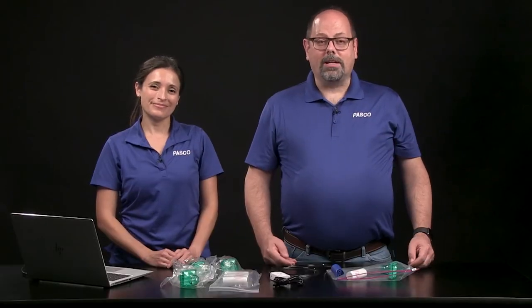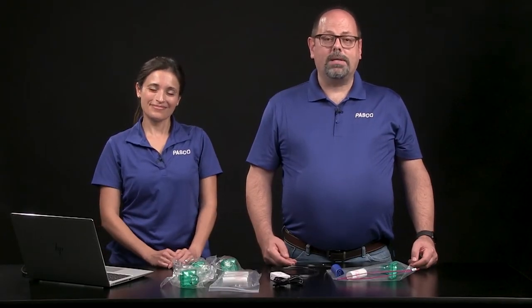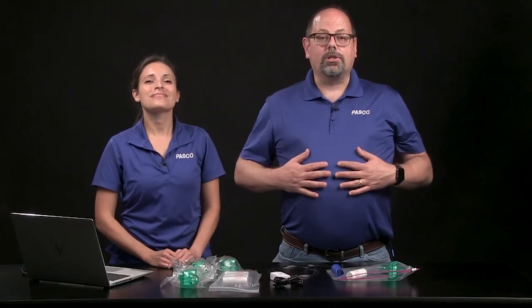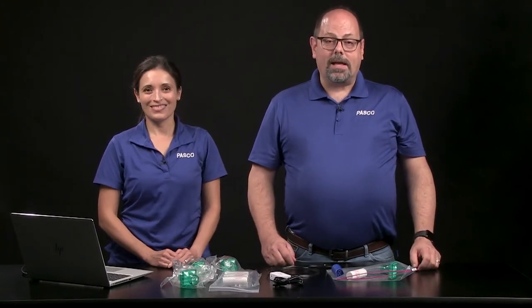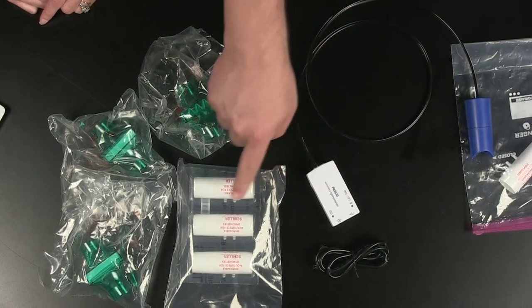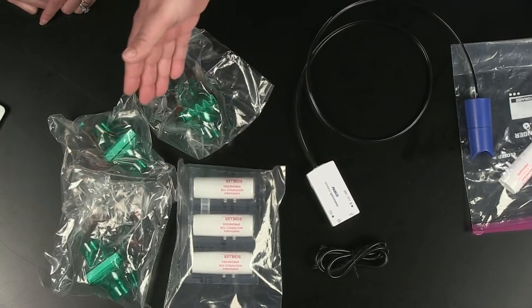A spirometer test shows lung volume patterns that help assess lung function. A spirometer is a device that measures pressure changes and determines the air volume moved in and out of the lungs while breathing. PASCO's Wireless Spirometer comes with a USB charging cable, three mouthpieces, and three filters.